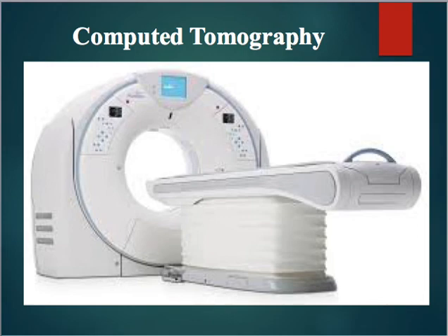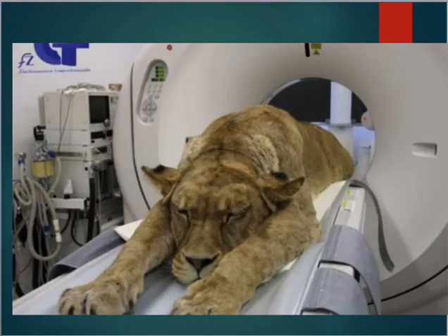So, sorry, I'm getting it to turn. So this is a literal CAT scan. A lot of veterinary hospitals have CT and MRI scanners that are capable of scanning large animals, such as this lion. And honestly, on occasion, all x-ray tables and CT and MRI tables have weight limits.